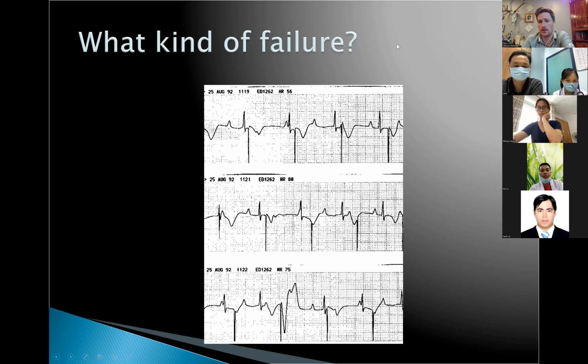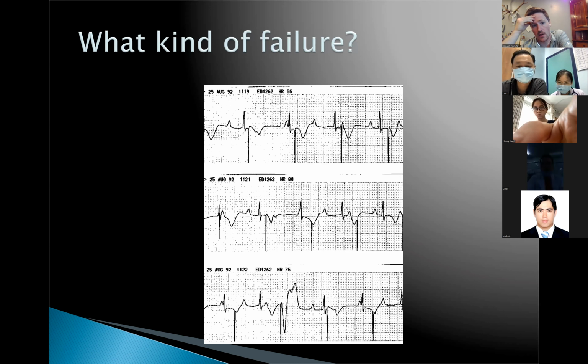So what kind of failure would this be? Well, we do see pacer spikes followed by a QRS. But we're also seeing native beats as well.